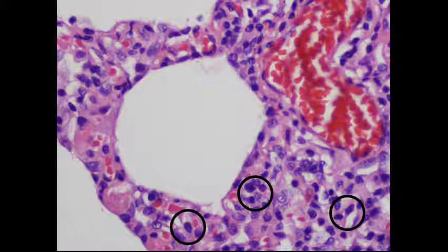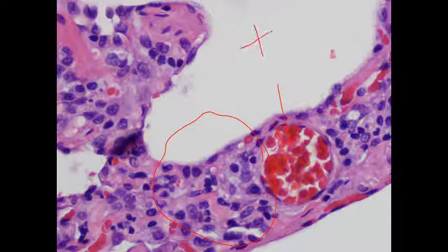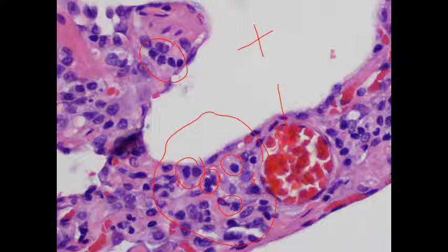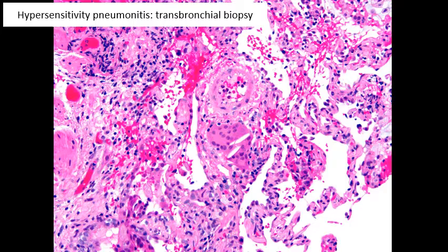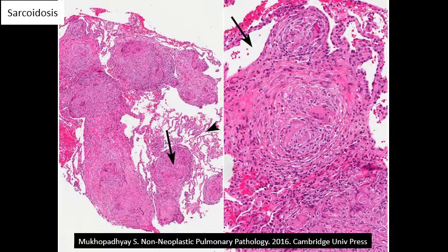At very high magnification, the cells within the alveolar septa are confirmed to be mostly lymphocytes, as shown by the circles. Another picture shows a capillary, the alveolar septa, the airspace, and within the alveolar septa are several lymphocytes — this is the hallmark of hypersensitivity pneumonitis. There is also a plasma cell visible. This disease can also be diagnosed on transbronchial biopsies — here a multinucleated giant cell with inclusions and interstitial lymphocytes in the background are clearly visible.